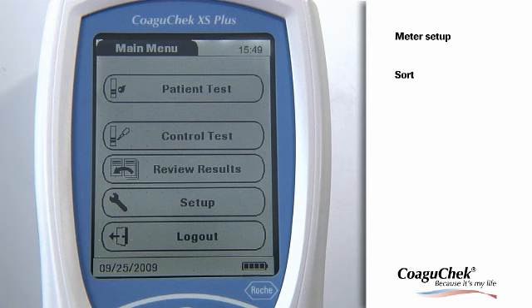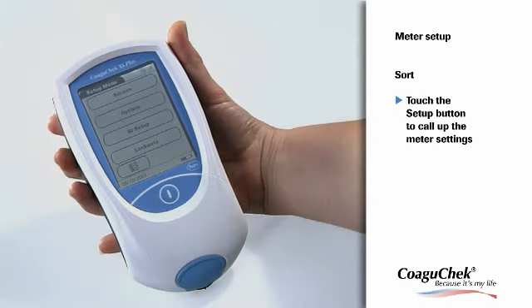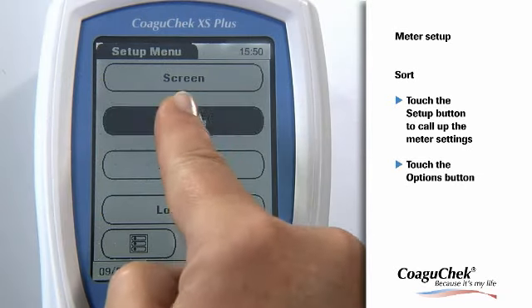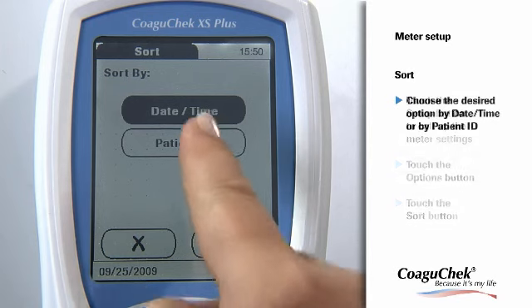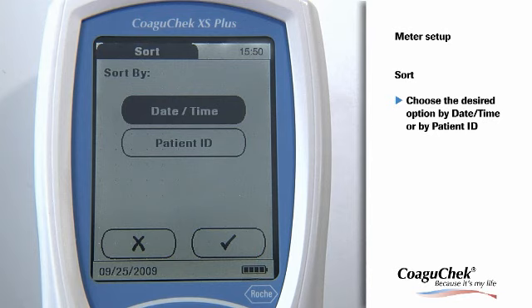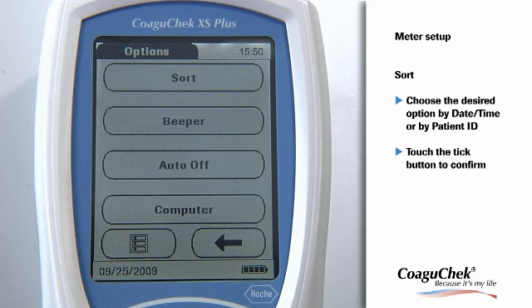The Coagichek XS Plus Meter offers several options for easy handling. The Sort option refers to the order in which measured and stored results are displayed when you use the Review Results memory function. From the Main Menu screen, touch the Setup button to call up the meter settings. From the Setup menu screen, touch the Options button. Here you can choose the Sort button. If you select the Patient ID button, the memory will be sorted according to the patient's IDs in ascending order. Please confirm your setting by touching the Tick button. The program automatically returns to the Options menu.